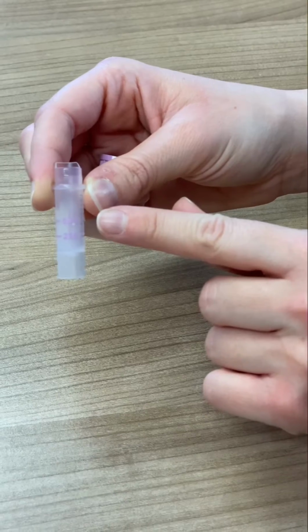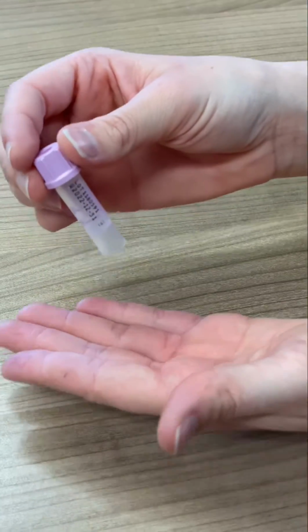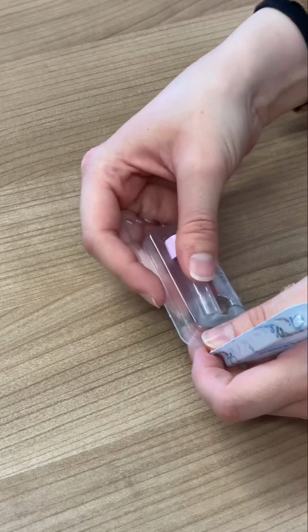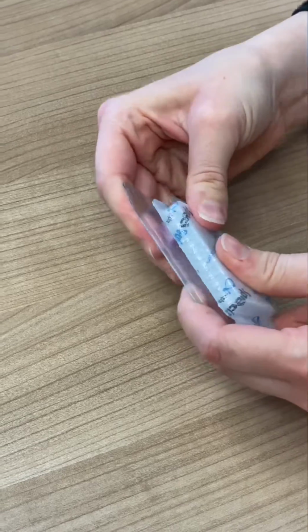Once you have filled to the 600 line, push the lid down firmly so it clicks, and then clean your finger with a tissue and apply a plaster. Put the sample tube inside the protective plastic case and store in the fridge until you are ready to post back all of your samples in the plastic envelope.